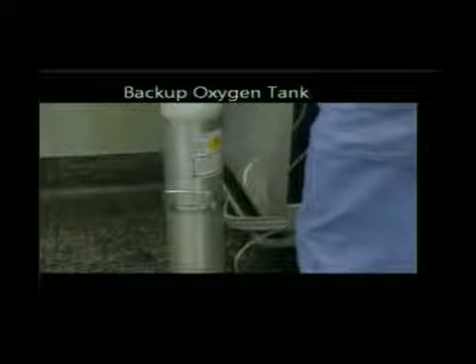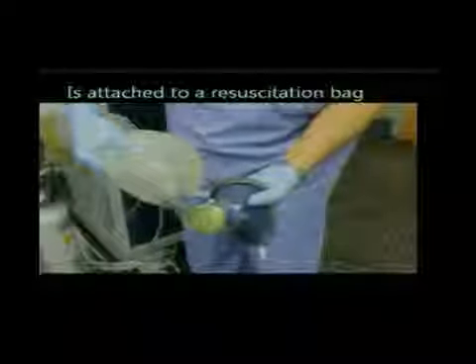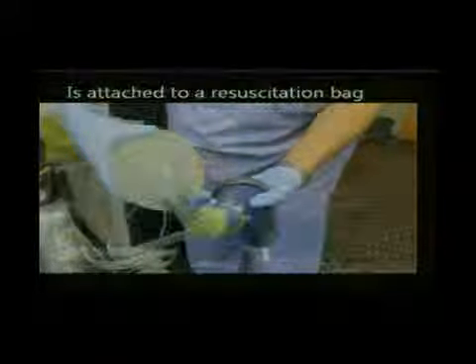So now we go to the backup oxygen tank. This is necessary for a variety of reasons, including the possibility that the main oxygen supply might fail. So in this case now, Professor Hung checks the backup oxygen tank and verifies that the tubing is attached. And that is also attached to a resuscitation bag. Now, please stop. This is a different bag than the first thing I showed you, which was the anesthesia circuit.